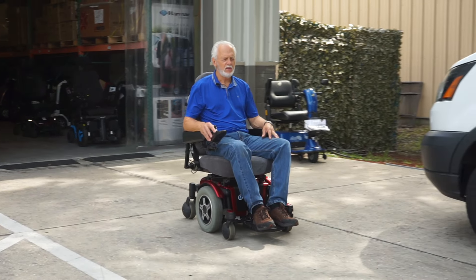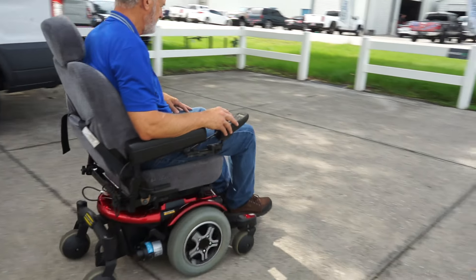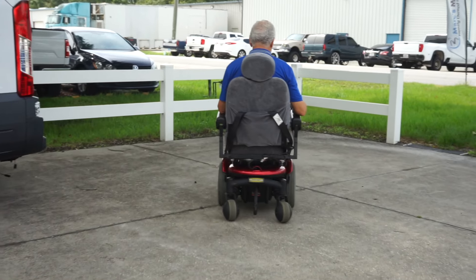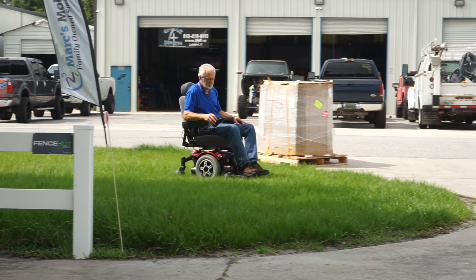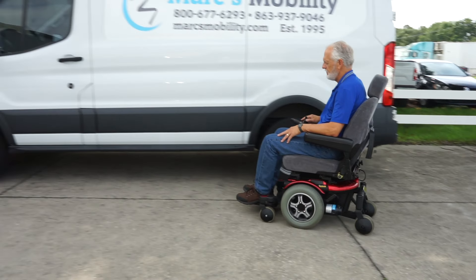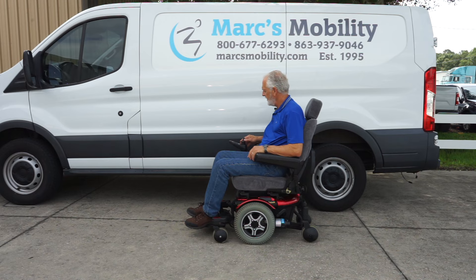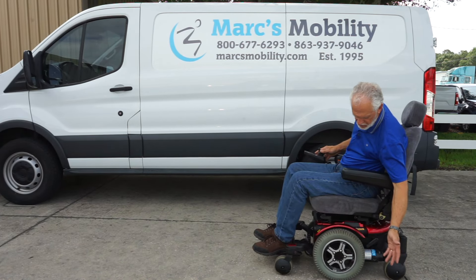When you stop, the chair will come to a halt automatically. This is the Quantum 600e with solid tires, six wheels on the ground, and the captain cloth seat, which is very rare these days — they're all vinyl now. If you like cloth, this would be a really nice one. As mentioned, it was used for six months to a year. It's an older model but still in excellent condition, and these are the original tires on the chair.